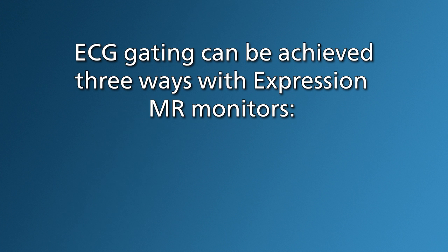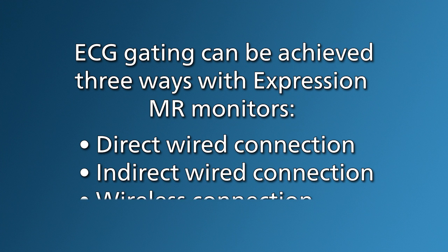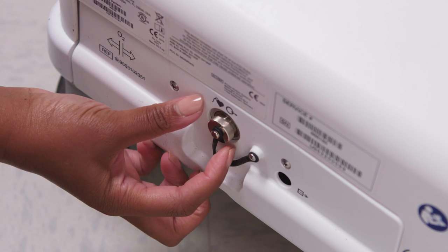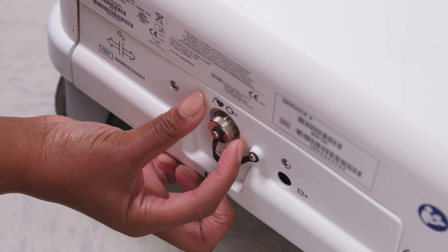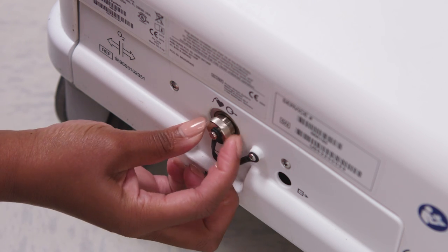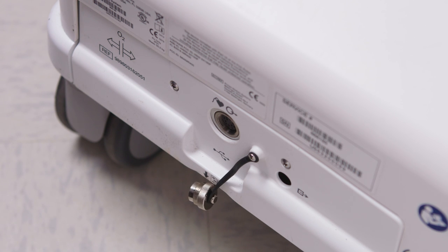ECG gating can be achieved three ways with Expression MR monitors – direct wired connection, indirect wired connection, or wireless connection. With a direct wired connection, the Expression MR monitor will connect directly to the external gating connection port on the MRI system via a gating cable.